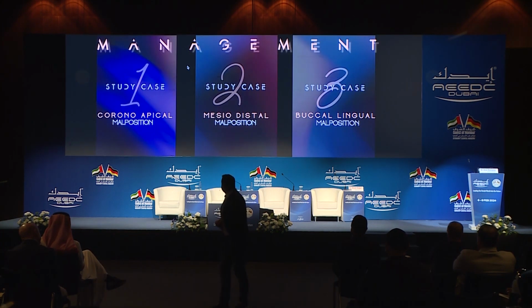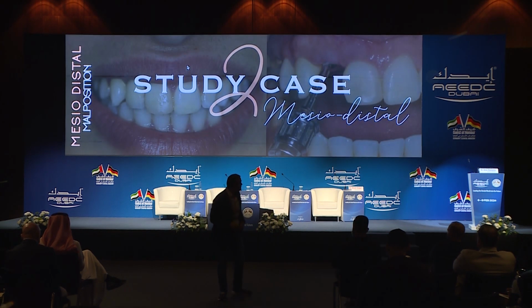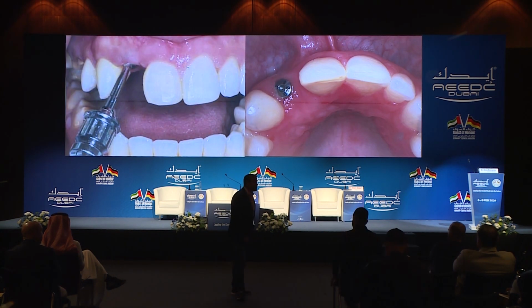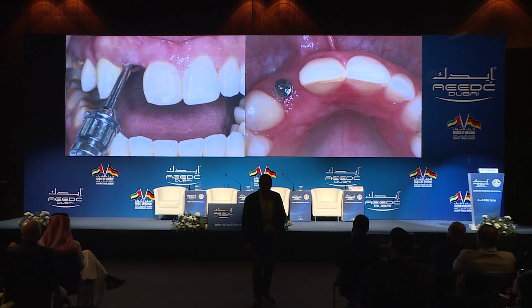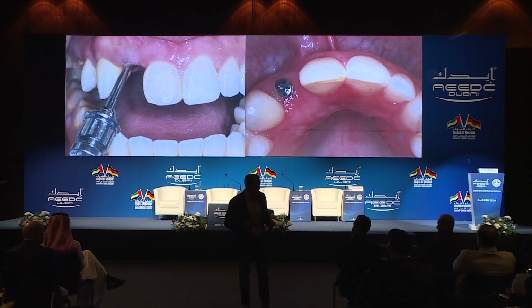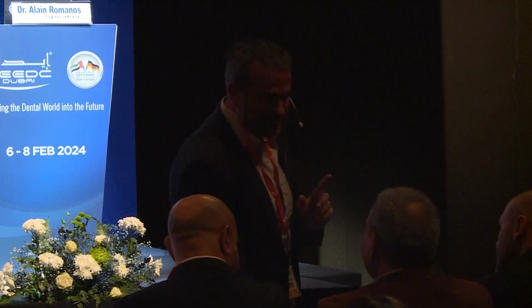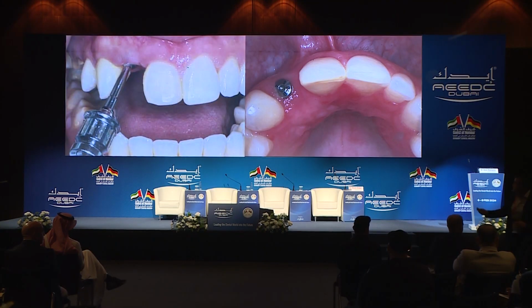Another case, what if you place your implant too close to the teeth? This is, again, another friend of mine, an oral surgeon. He was partying hard the night before, and then the next day he had this implant to place. And then he placed the implant, of course, in less than 1 minute, because, Imad knows, oral surgeons like to be really fast, right, Ricardo? Super fast, boom, boom, boom. And the challenge he was doing, if he can place the implant in less than 1 minute, which he did. But this is the result.